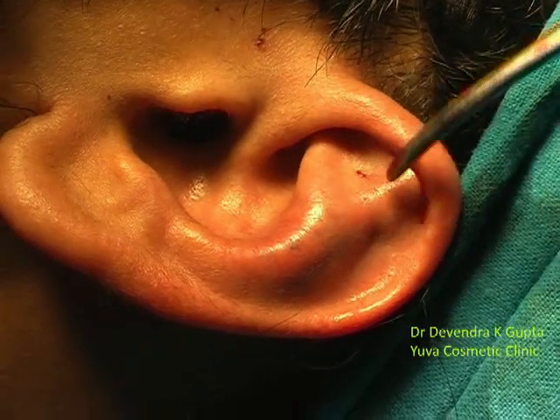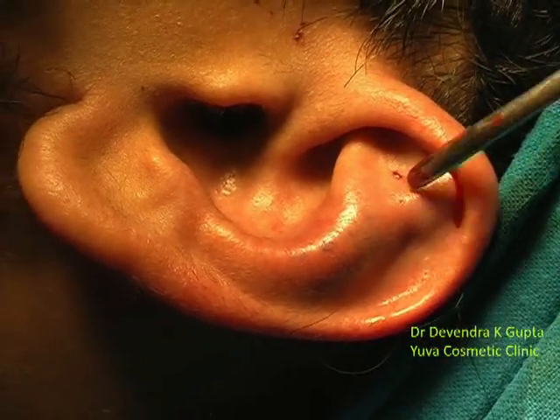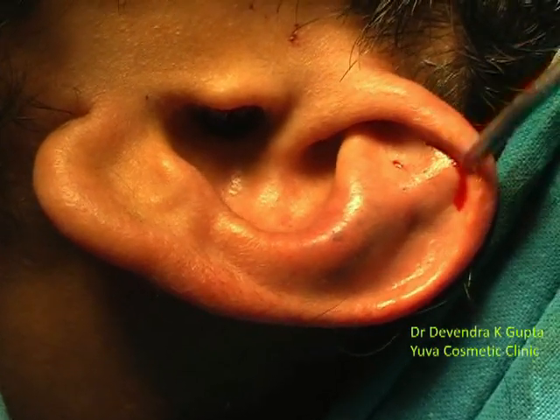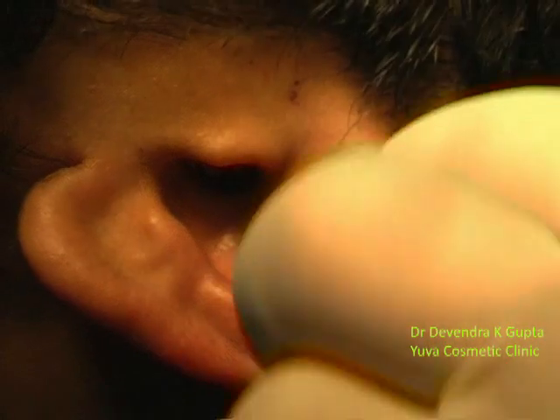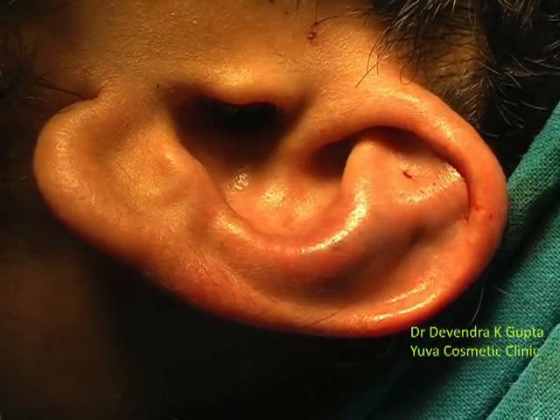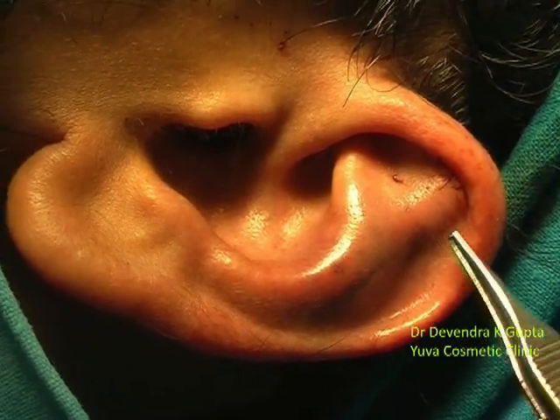You can notice that I have made a 2 mm incision in the triangular fossa, and through this I have negotiated 5-0 prolene to bend the anti-helical border, which I have already weakened with the help of the motorized diamond abrator. This incision is small — about a few seconds to close — and I will stitch it with only three 8-0 polyamide stitches. Notice the beautiful bending and curvature of the anti-helical border. This is basically the triangular fossa here; the stitch line hidden inside is very difficult to see and will not be visible in the post-operative phase.